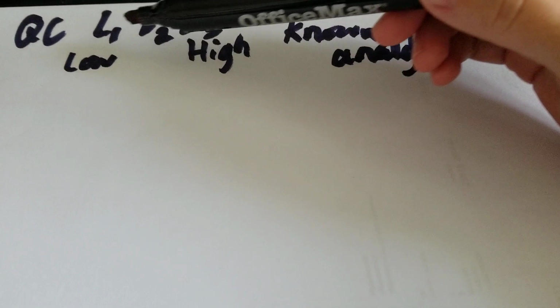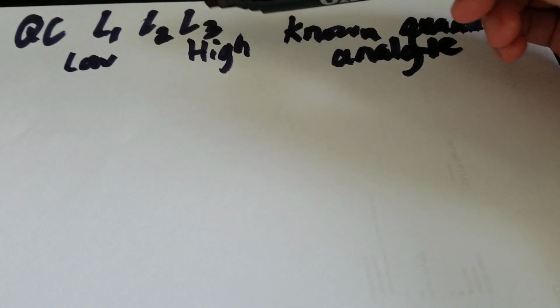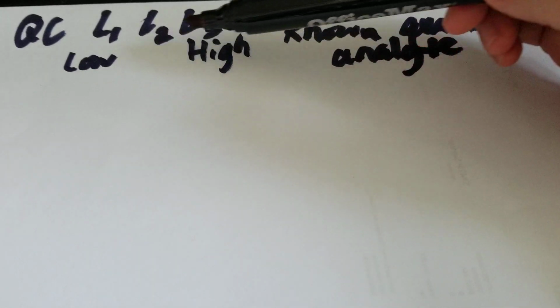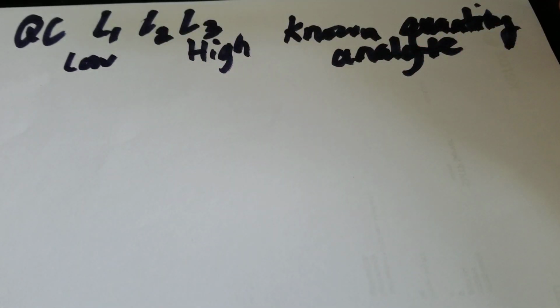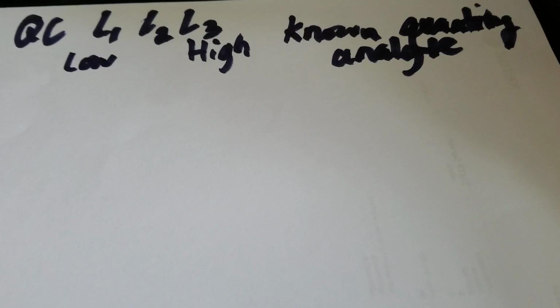And in each of these, you'd have a level that is either within the low range, the middle range, or the high range of that analyte's normal reference range, or above for the high, and below, obviously, for the low.